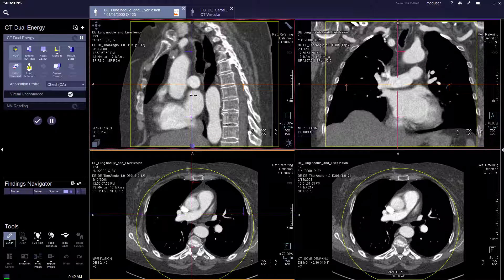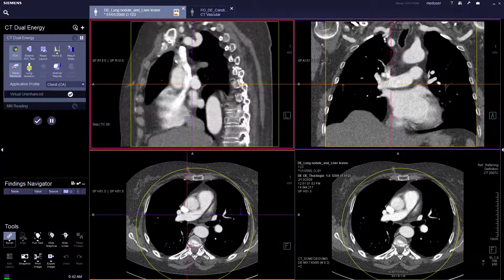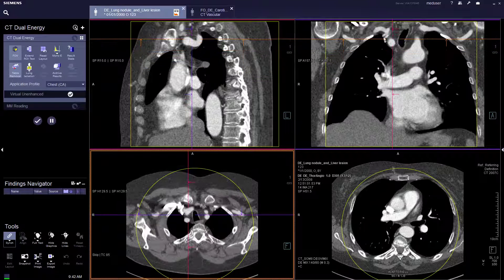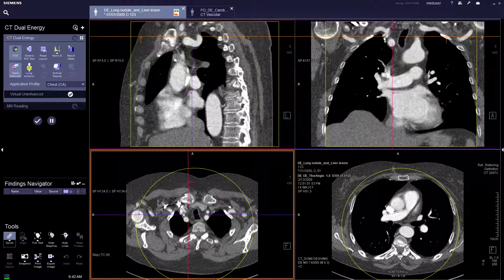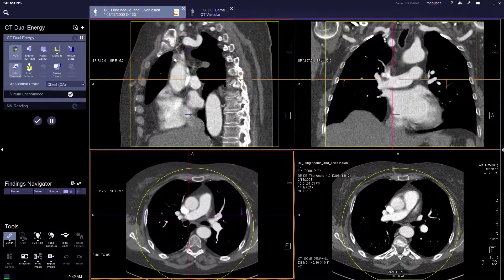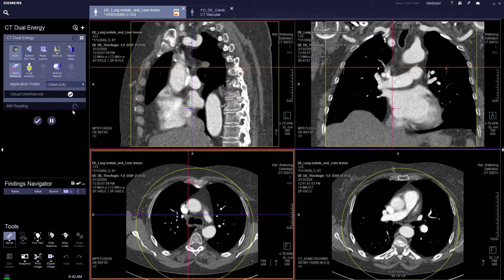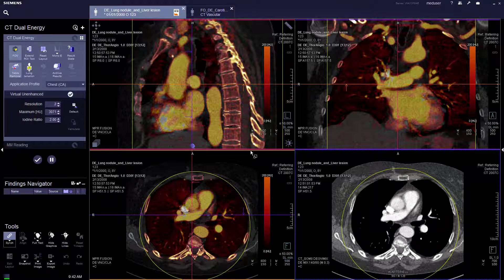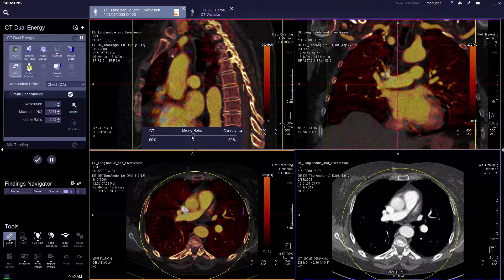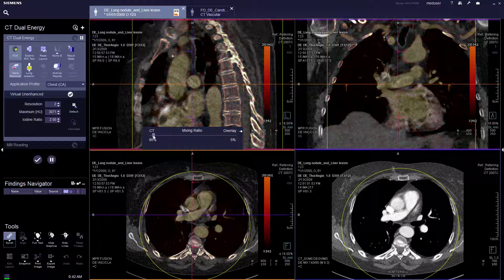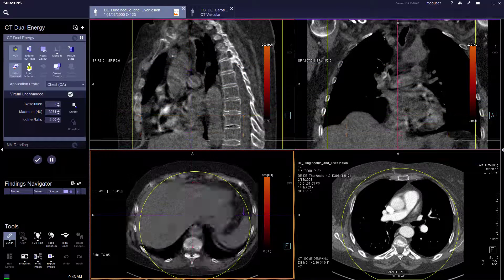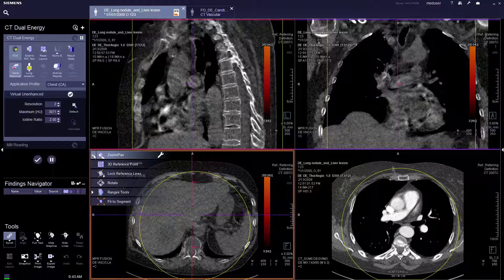Virtual unenhanced is great for contrast cases in which the user can create virtual unenhanced series. Just click on the virtual unenhanced application. There will be a contrast indicator shown in red, and you can change the mixing ratio to show the virtual unenhanced. This can be saved as a new series using parallel.